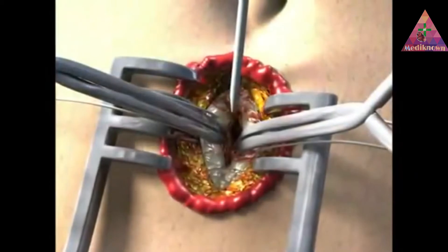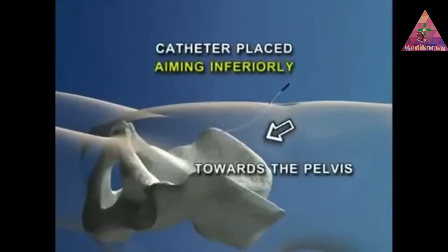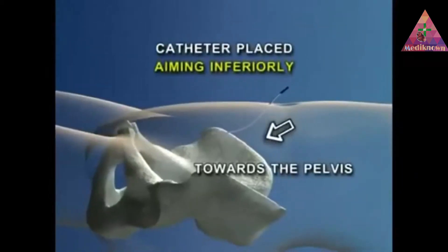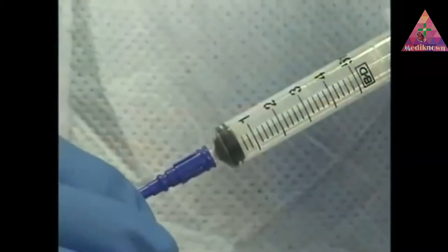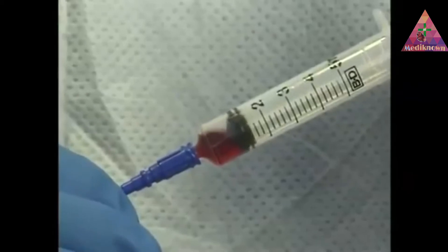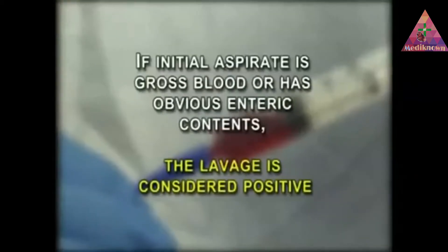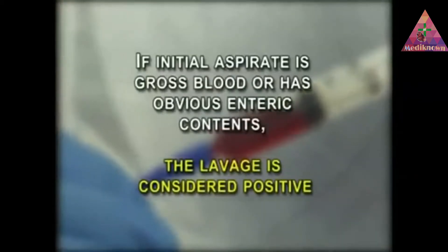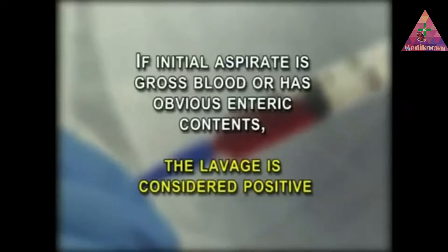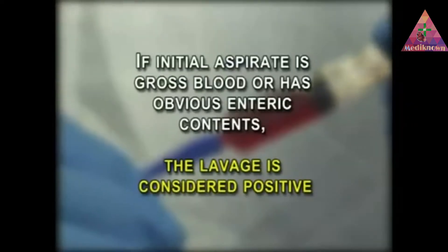The peritoneal lavage catheter is then placed into the abdomen, aiming inferiorly towards the pelvis. A syringe is attached to the catheter initially to allow for the initial aspiration of any blood or abdominal fluid. If the initial aspirate is gross blood or has obvious enteric contents, a lavage is considered positive.